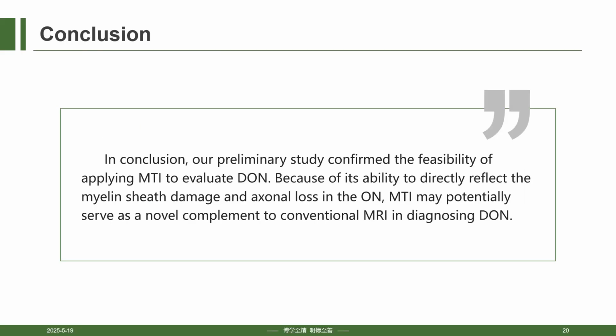Finally, let's make a summary. In conclusion, our preliminary study confirmed the feasibility of applying MTI to evaluate DON because of its ability to directly reflect the myelin sheath damage and the axonal loss in ON. MTI may potentially serve as a novel complement to conventional MRI in diagnosing DON.